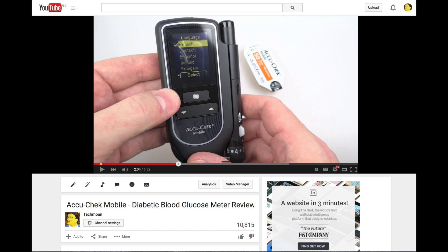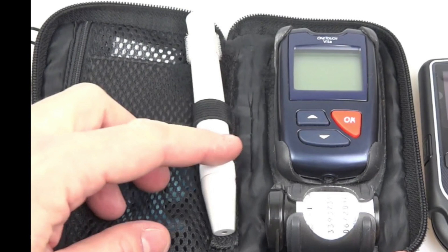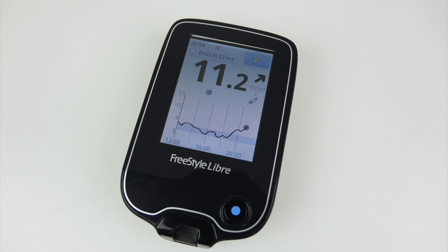A year and a half ago I reviewed the AccuCheck Mobile, which was a big step up over the previous devices I'd been using, but of course time doesn't stand still. I've finally managed to get hold of a new device called the Freestyle Libre. I've been using it for a fortnight and it really has changed my life — I'll explain a little bit more.